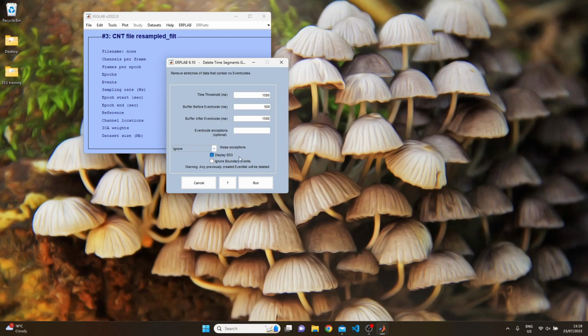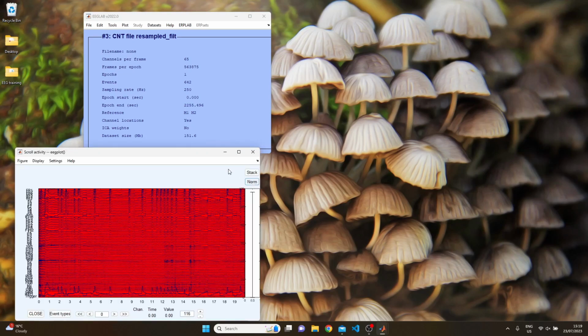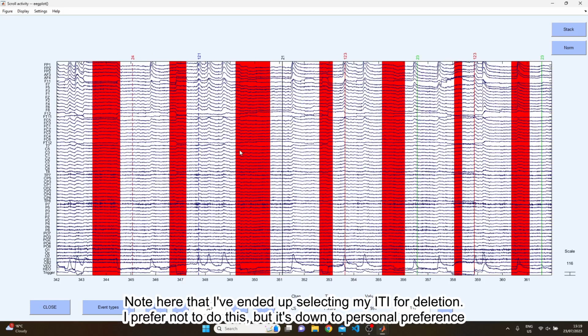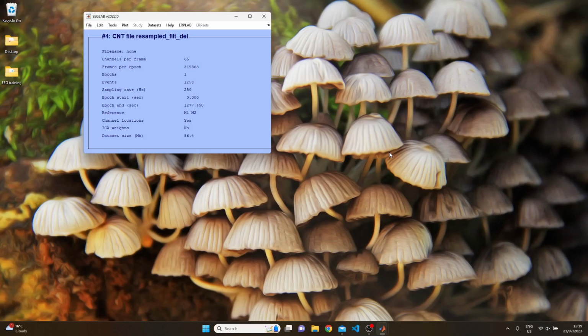You then want to ensure that display EEG and ignore boundary events are ticked. The ignore boundary events box just means that if you have a break in your EEG data, you might have paused the recording for some reason, it's not going to count that as a meaningful trigger. So then you want to press run, and you can now see the data that will be deleted highlighted in red. Have a scroll through this using the left and right arrow buttons just to make sure that you're not deleting anything that you actually would much rather prefer to keep, and you don't need to adjust any of the buffer periods or time intervals. If it's okay, press OK. If it's not okay, press cancel and go back and change the input criteria.